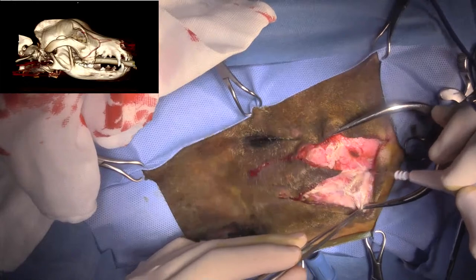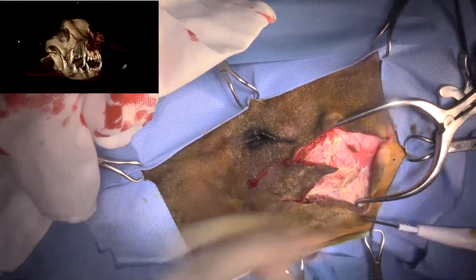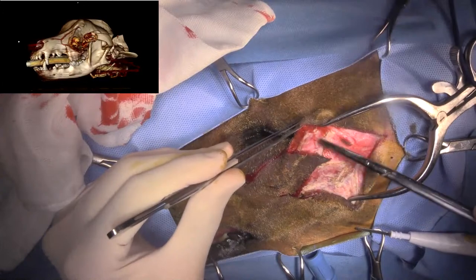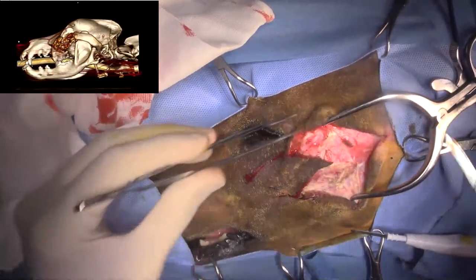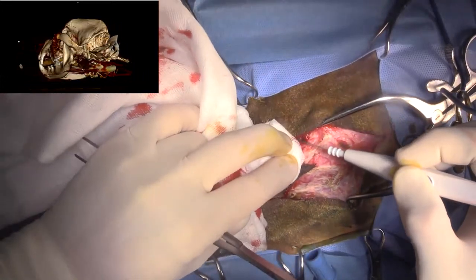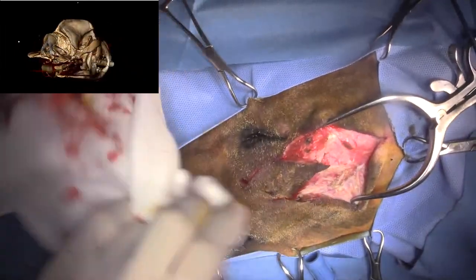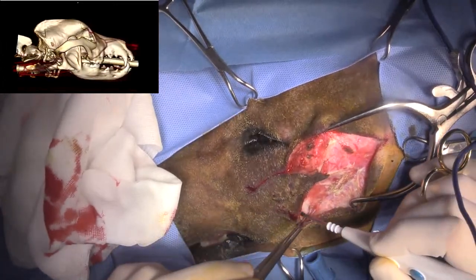Getting through platysma muscle here. See if these scissors look better. Black ones. They're still not great. Maybe it's just the tissue is so tough. Yeah. We have a branch of the facial vein up here that we're going to encounter.